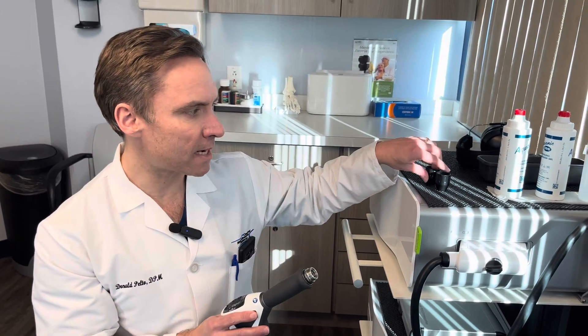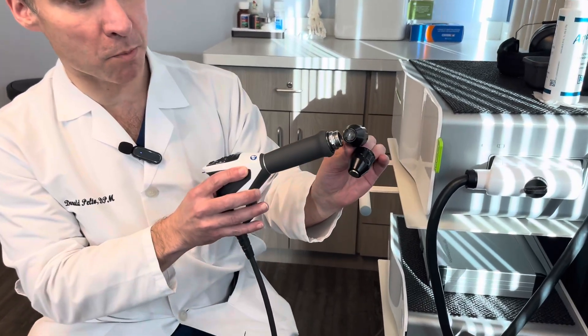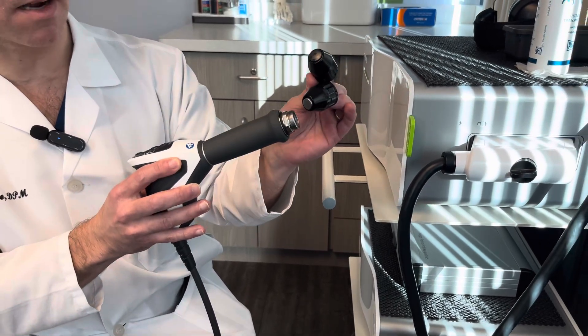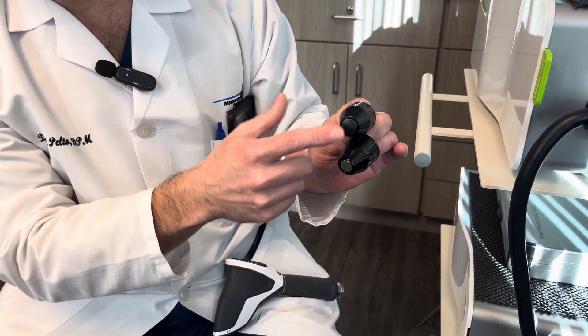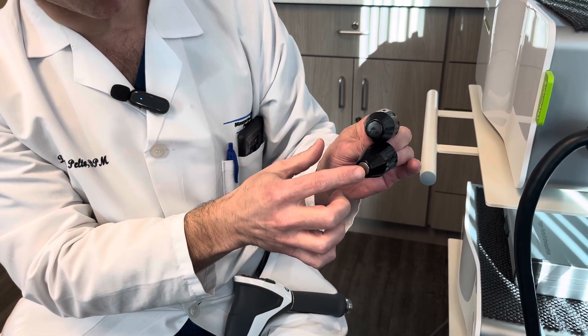There are two main tips we use in podiatry. One is called the cobalt tip, which is a darker blackish color, and the other one is metallic. If you compare the two of them, the cobalt one is bigger and softer, and the metallic one is smaller and harder.